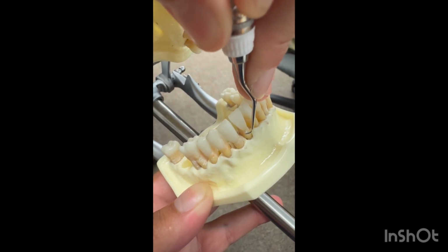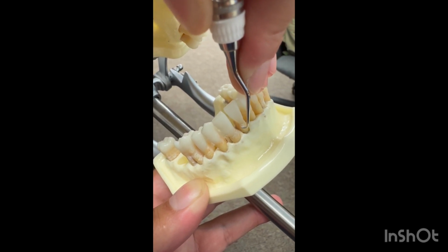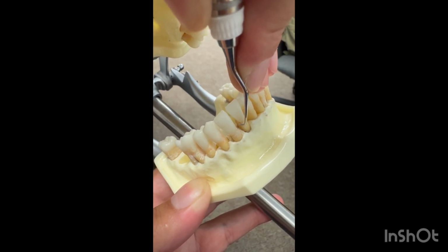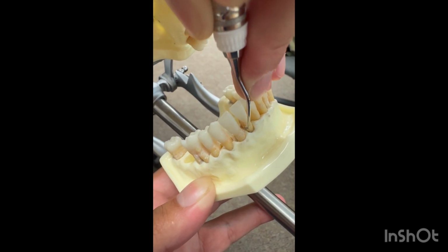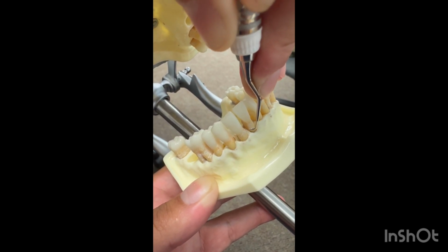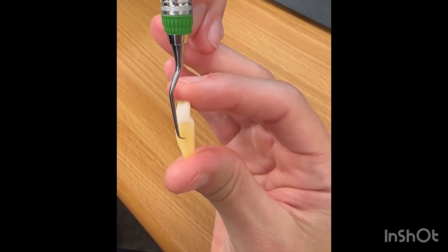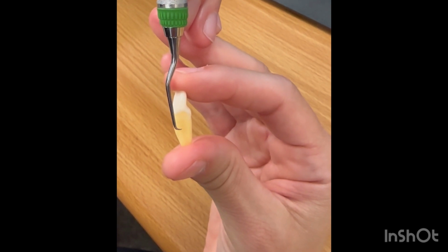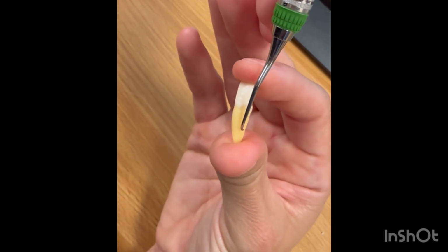For 6 millimeters of bone loss, we would still use the 7/8 and the 5/6 mini, as the longer terminal shank is still advantageous, and the thinner blade makes gingival insertion easier for those deeper pockets. The 5/6 mini is also area specific, so it offers better adaptation and control.